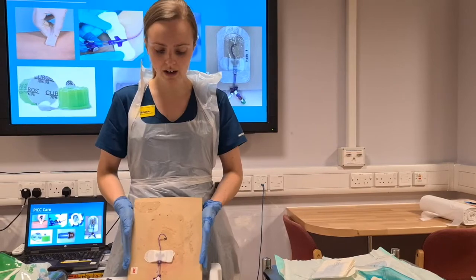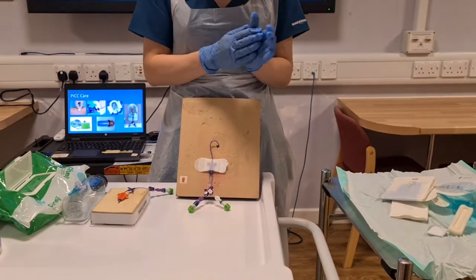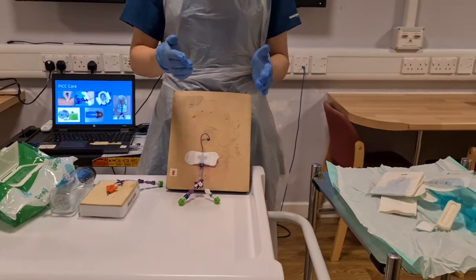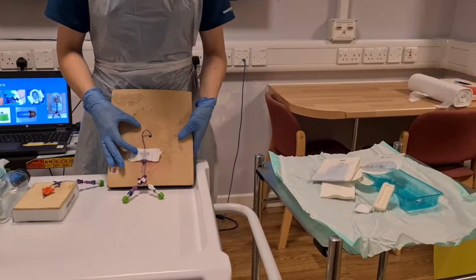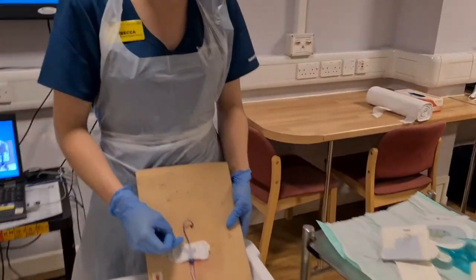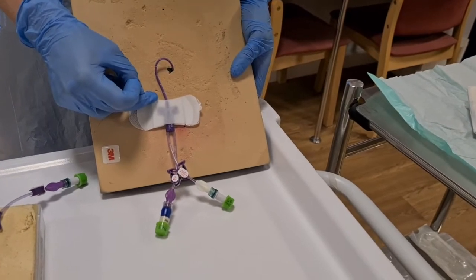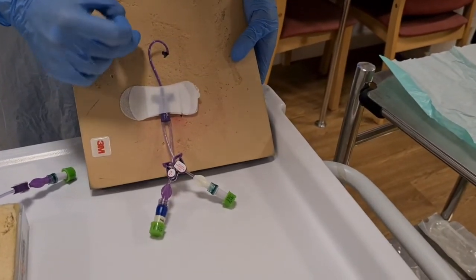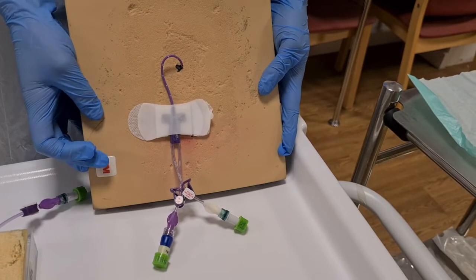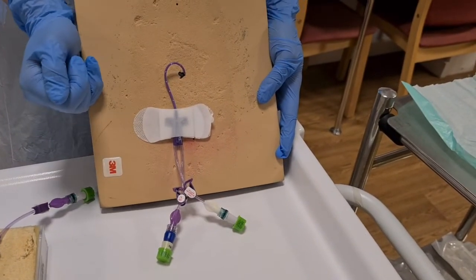To know if the line has moved, what you need to do is have a look at the insertion site documentation and then have a look at the line now. As you can see, there are white dots on the line, so you need to count the white dots. Ignore the numbers, that is for insertion. Mine has 1, 2, 3, 4, 5, 6, 7 centimetres migration. So you always read between here and your insertion site.